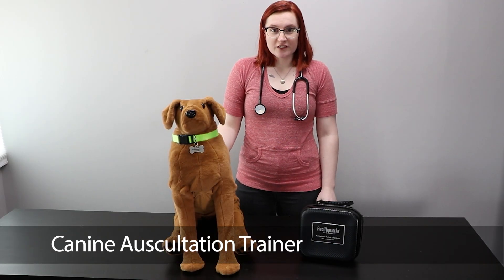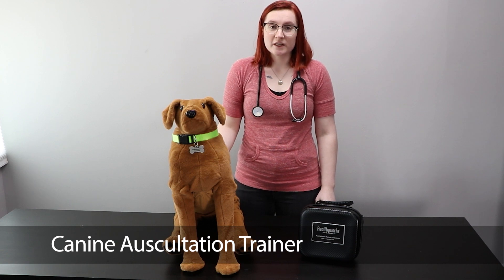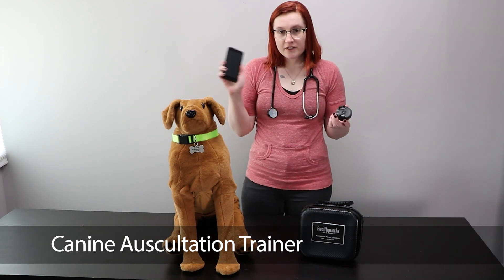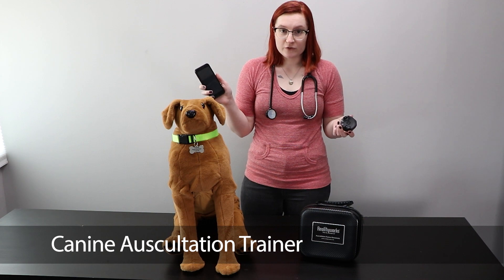This is our K9 Auscultation Trainer. This unique teaching tool helps students learn how to auscultate for over 20 heart, lung, and bowel sounds. It comes with a RealityScope stethoscope attachment, a smart device with the pre-installed K9 Auscultation Trainer app, and downloadable curriculum.